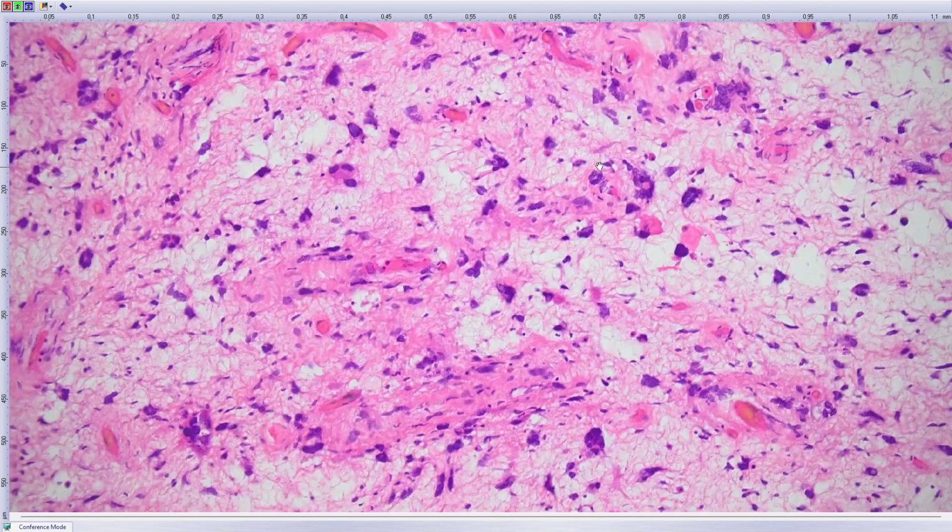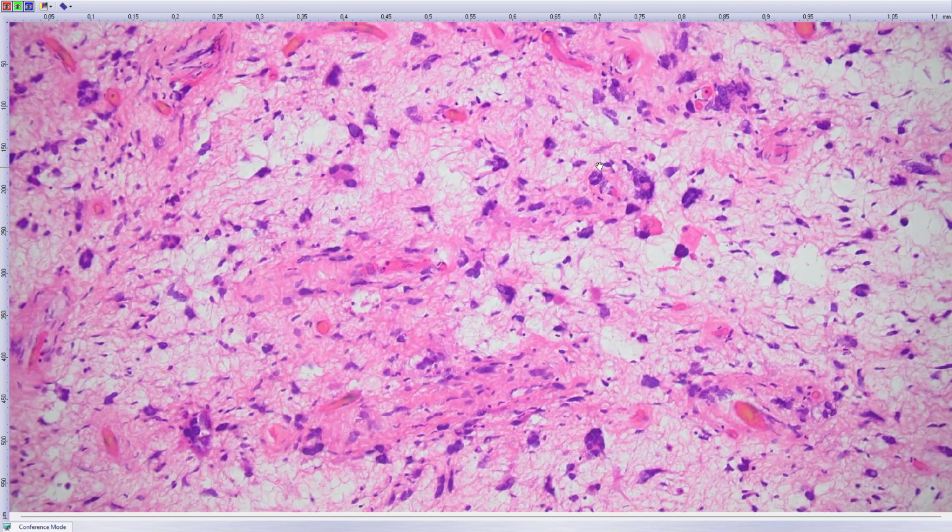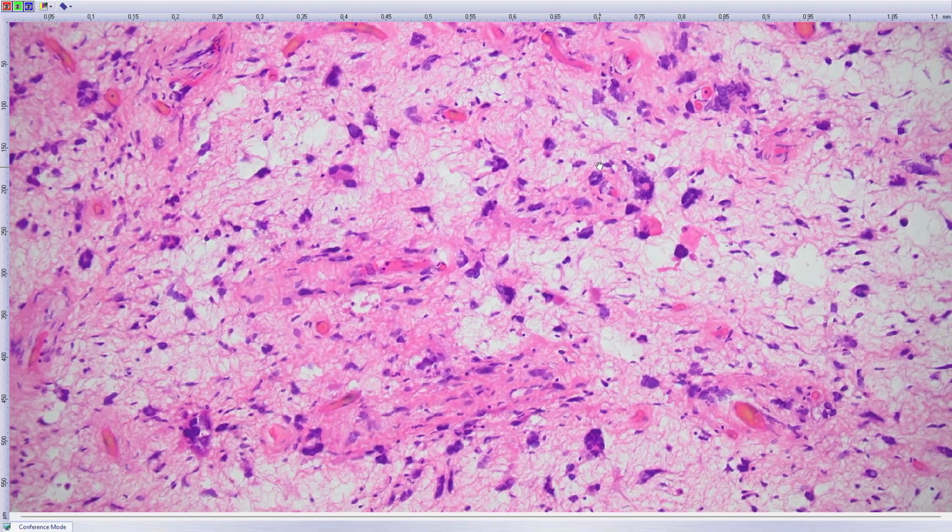So I'm sure that in the past, all these malignizations of angiofibromas of vulva are this, and it's a perfectly benign lesion. Yeah, it's a very important thing. We have several cases, and it's not as rare as one would think.